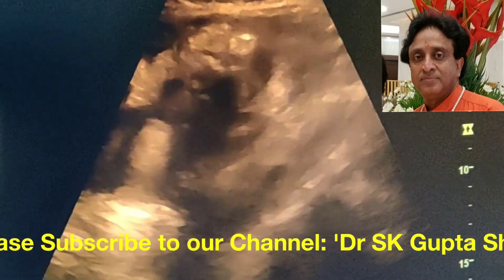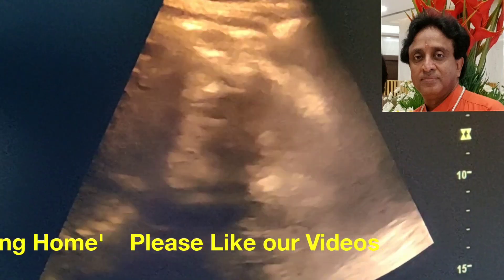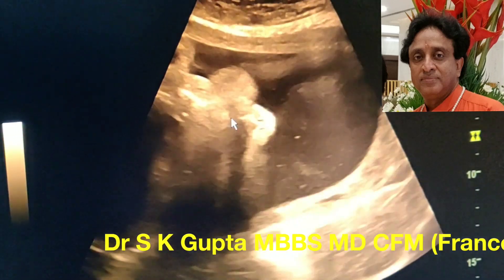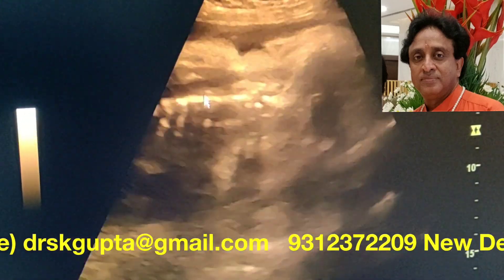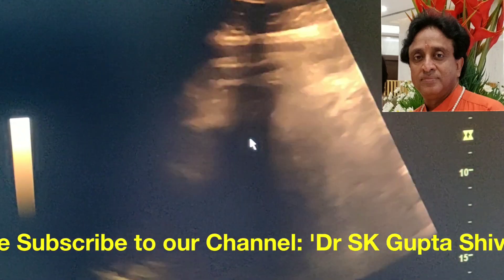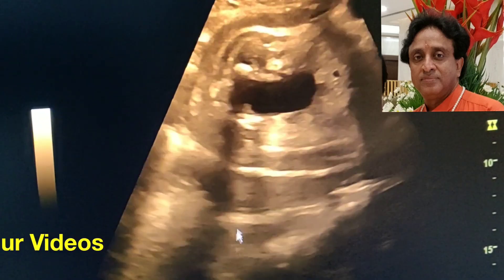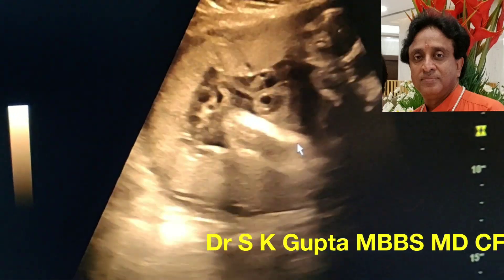I will show you another case of similar gestation where you can see that at 32-33 weeks of gestation there is a good amount of fluid around the baby — good amniotic fluid around various organs and the echogenicity of the baby is nearly normal. Now going back to our own case, you can see that the fluid around the fetus is pretty low, and this is obviously a case of oligohydramnios.